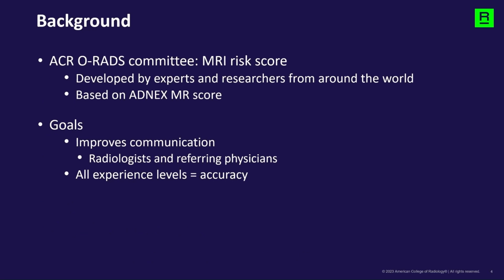So how did the MRI risk score come about? Well, the ACR O-Rads committee, comprised of experts in the field from around the world, came together, and based on the ADNEX MR score, they developed the O-Rads MRI score. O-Rads is unique in terms of its strong evidence basis, with the risk stratification system based on prospective data from more than 1,500 women.